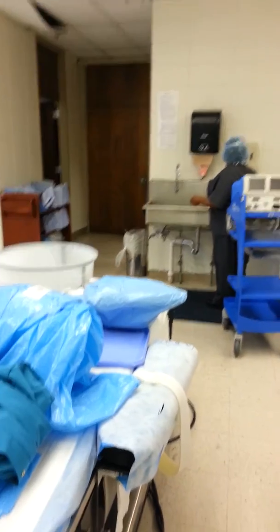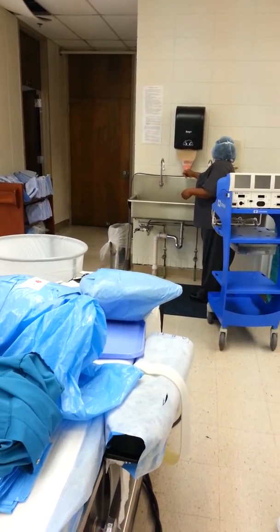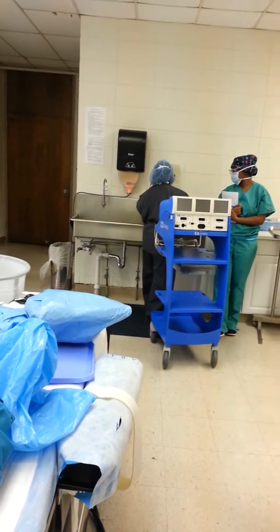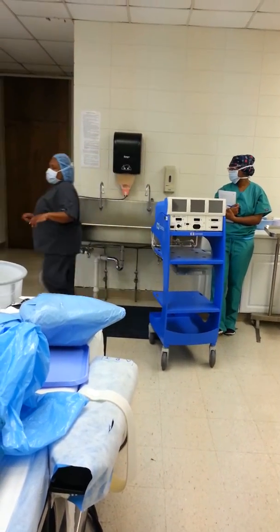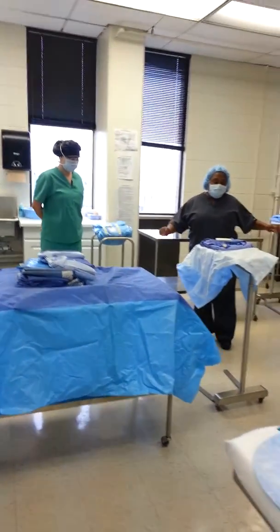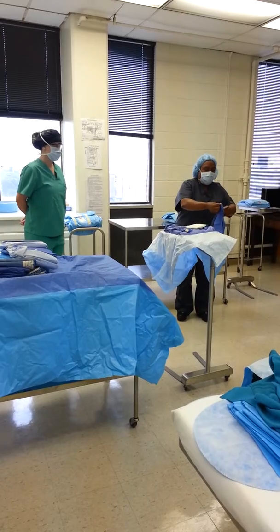I'm going to just wet my hands. And this should take you, what I'm about to do, no more than 5 to 7 minutes to complete.